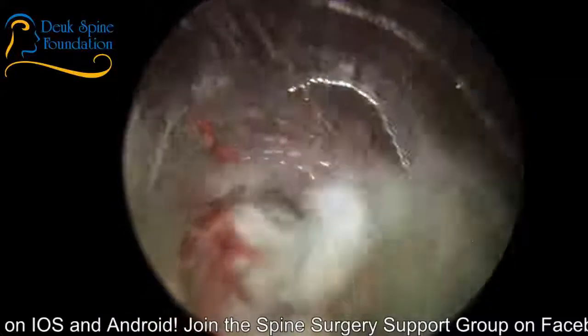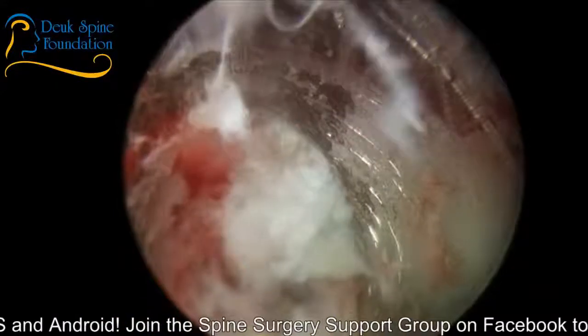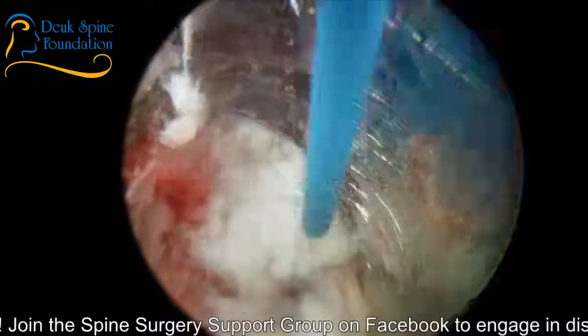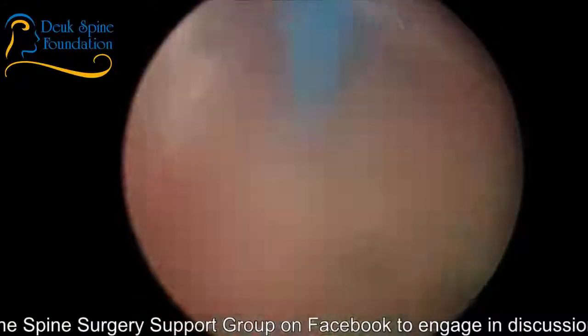All right, any other questions? So we're inside this disc, and this is the tear and part of the herniation right here. So I'm going to use the laser to remove it.